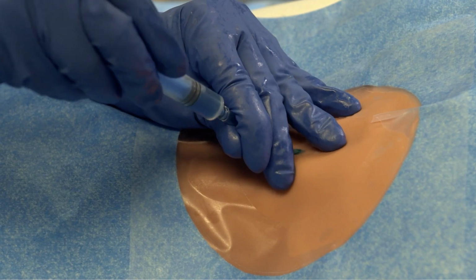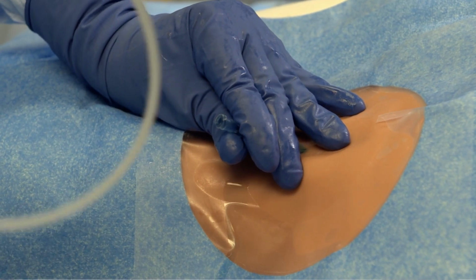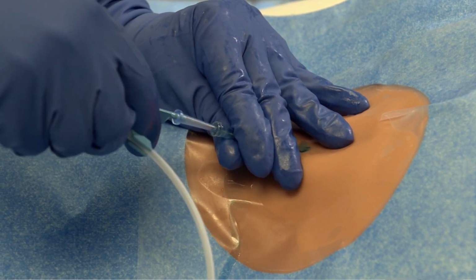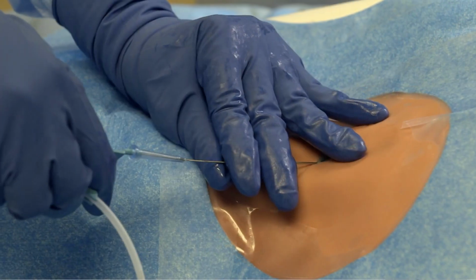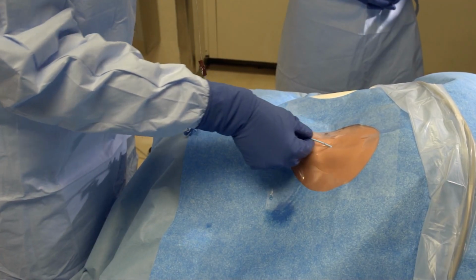Once venous return has been established, be mindful of gross contamination when removing the guide wire, as blood exiting the finder needle may contaminate gloves or other parts of the PPE. Handle the guide wire with care to prevent it from uncoiling and splashing blood.